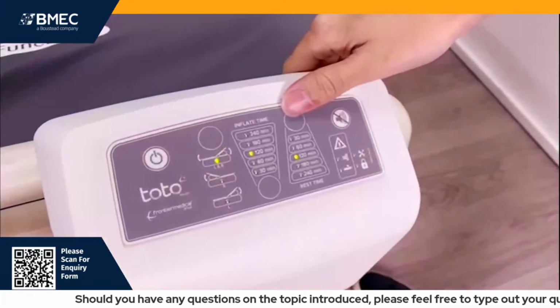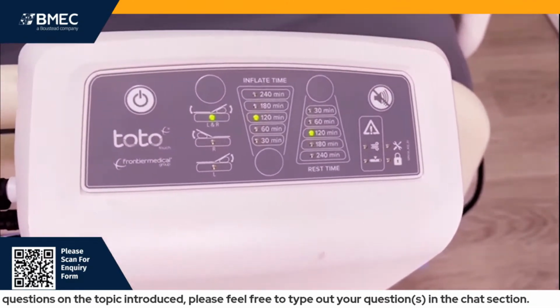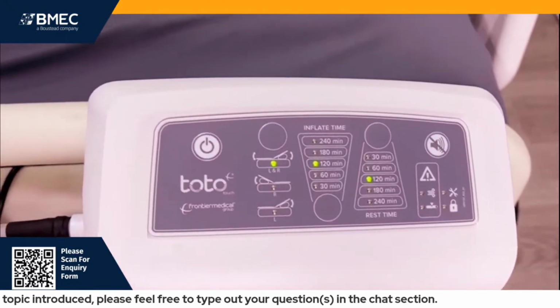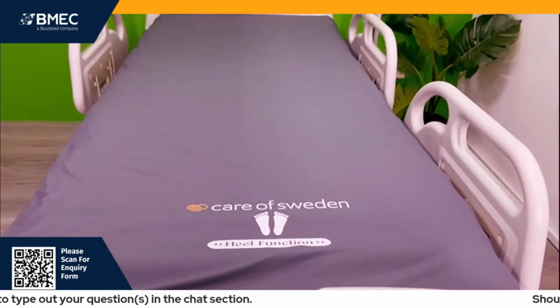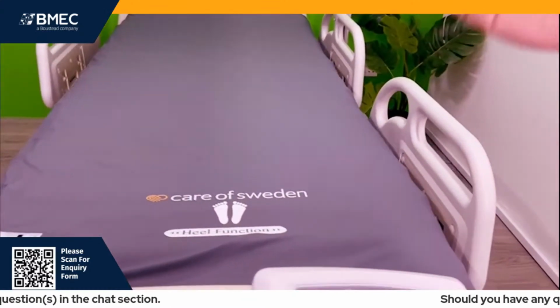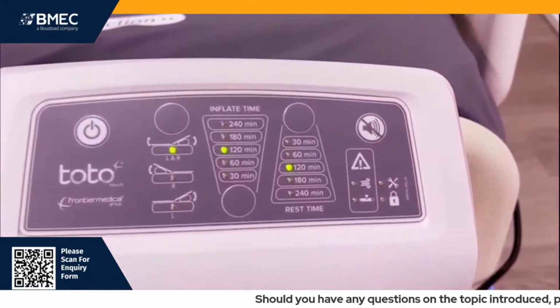Moving on, the next one would be the rest time. Likewise, rest time would mean supine position. You can set the time that patients want to spend in supine position, either 30 minutes all the way up to 240 minutes. Lastly, for this, it's the mute button.